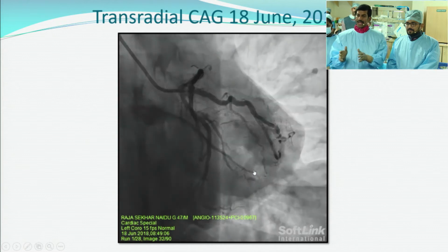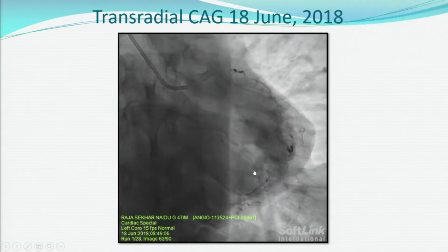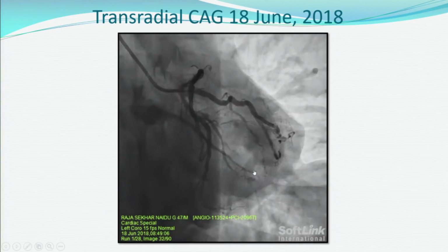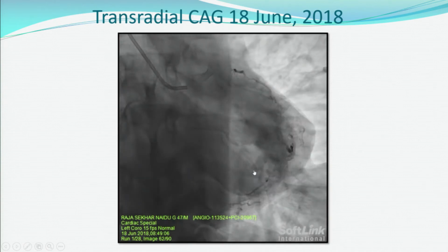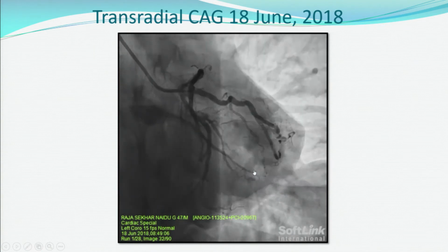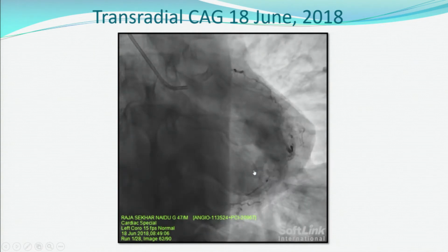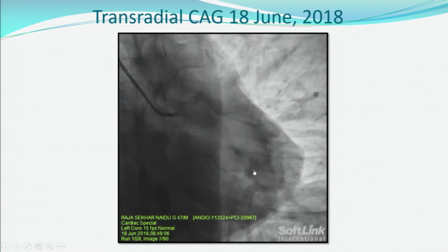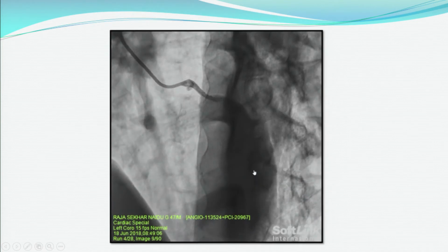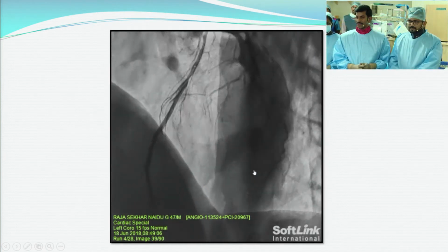We'll show you the angio run, transradial. We did it 2 days back. Can you see the angio runs there? The LAD stent is seen. A big ramus, that is fine. The small collateralized diagonal as before. The next angiographic shot shows that the problem is in the stent.